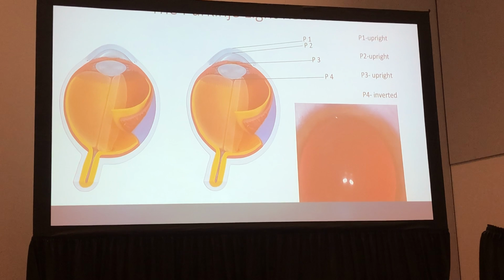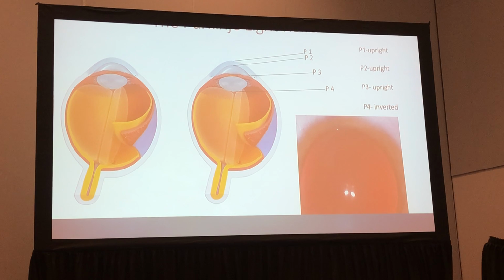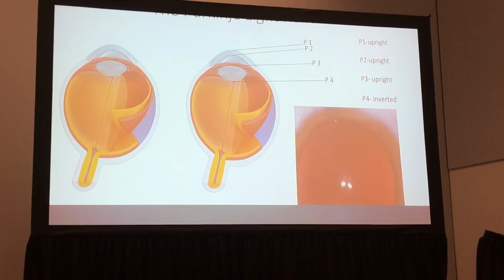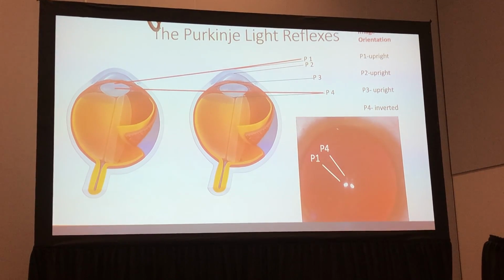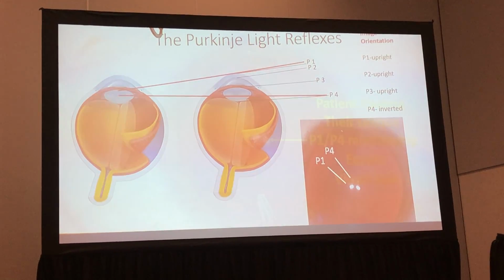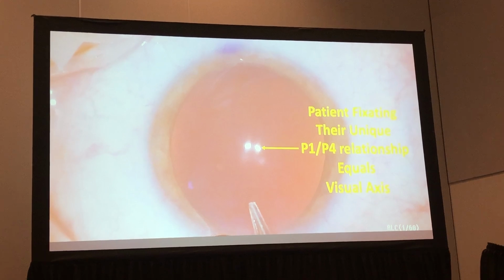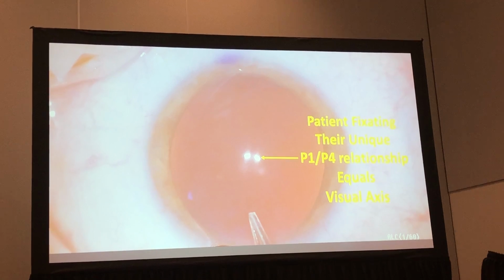So by having the patient fixate on the microscope light, you can, like in the lower right, get those Purkinje reflexes to overlap, or you nudge the IOL till they overlap, and then you can be sure that you have put it in their visual axis, and not necessarily what you thought was the anatomical center. So this is what you're looking for, to get those light reflexes to overlap a bit. So here's what you want when you're done. Patient, fixate on the light, and what I'm getting is that relationship on the visual axis, center of the multifocal, and I should be good to go.